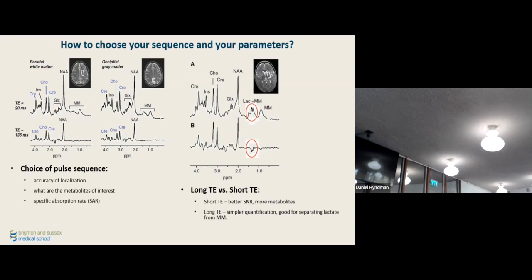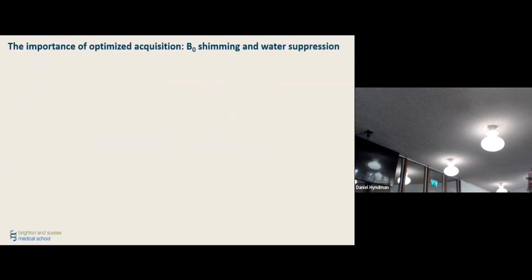It is RF intensive, so if we go to high field, it can be quite a restricting thing with respect to the repetition times. So there are different considerations. We will not get into the details, but just to give you an idea that there are issues involved and that we are trying to come up with recommendations that will help people make the decisions of what would be the best way to choose.